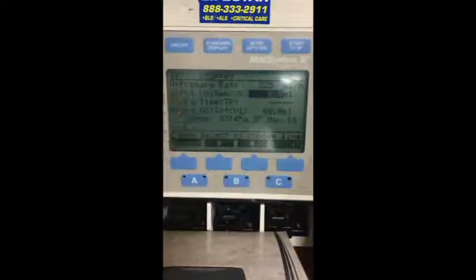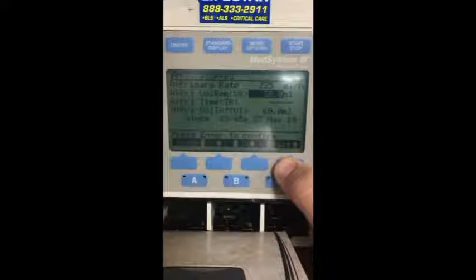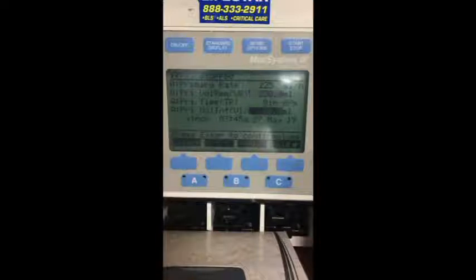Volume remaining, VR, is how much is left in the bag. So we're choosing that we have a 250 ml bag, and enter, confirming it. And then the volume infused is what you've already infused. You'll want to hit the clear button to clear that out, so that you can see now our primary rate is 225 mLs per hour. Our volume remaining is 250, and the volume that we've already infused is none.